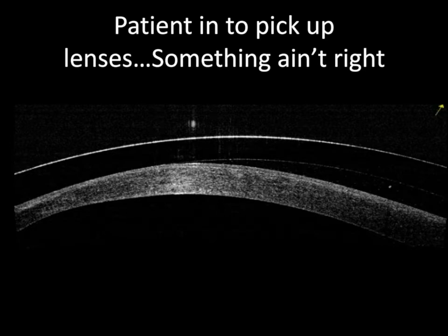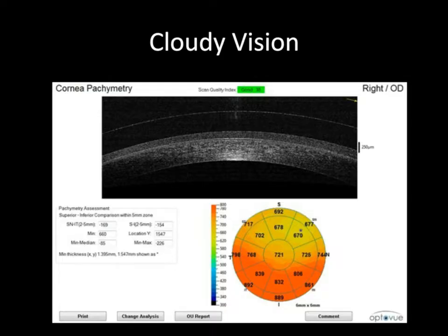So our technician graciously walked into the room, said, Dr. B wants you to try on another set of lenses, and we did so accordingly, and the next set of lenses fit perfectly. But what this also does is it gives you an idea and perspective of what some of the problems are that a patient may be having with scleral lenses. So prior to me entering the exam room, I have this picture, and I have a pachymetry scan, so I can actually look at it anywhere I want around the cornea. And what you can see here is that the fluid is significantly cloudy. So I know that I'm dealing with a clouding situation.